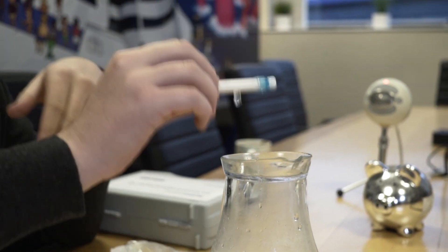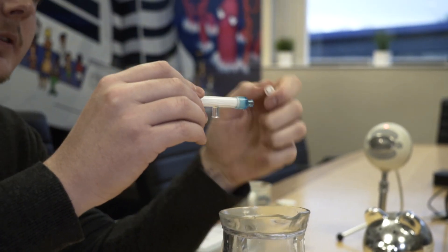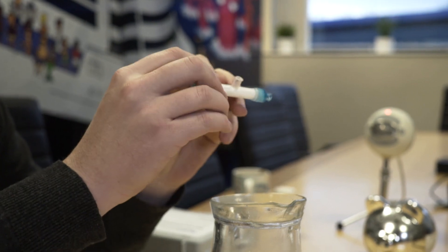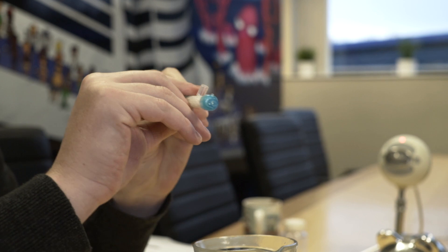So what we're now going to do, now that the filter is completely coated in the sample water, is take the white cap from one end, switch it around, and put it on the other end.